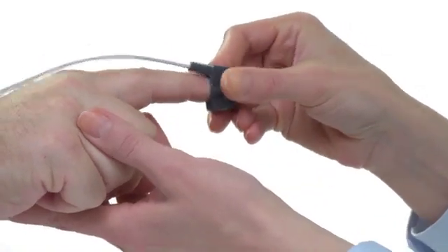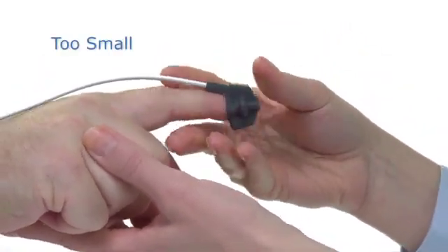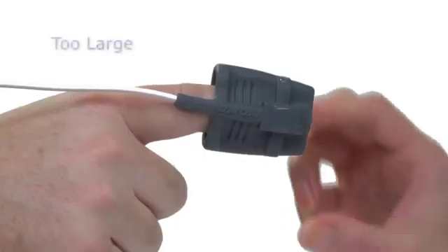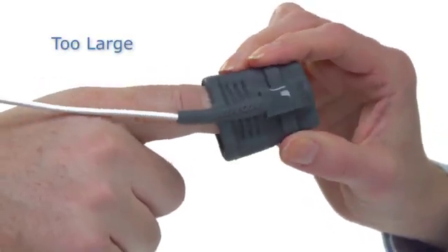Do not attempt to squeeze the finger into a sensor too small for the digit. Pressure can restrict blood flow and affect sensor accuracy. Too large a sensor may move, compromising signal capture.